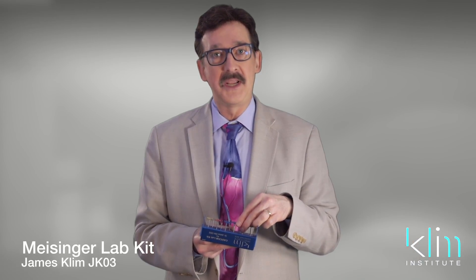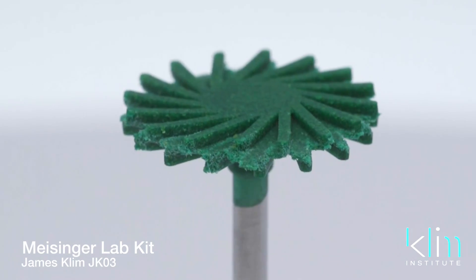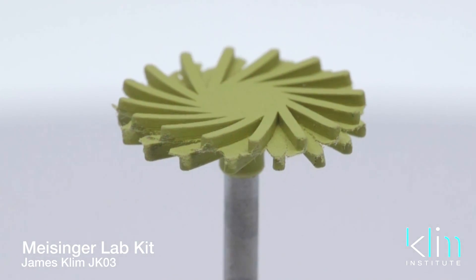The new addition to the JK03 kit are the twist polishers. They come in the green coarse, the medium blue, the fine pink, and the extra fine which is the yellow.